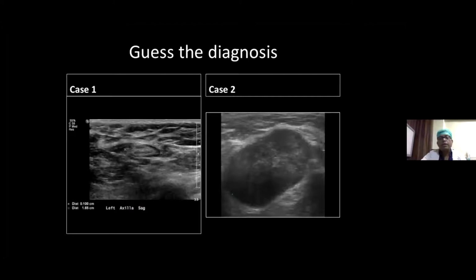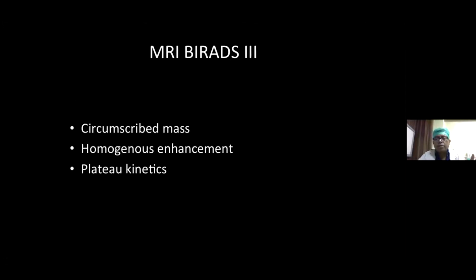But as I said, this is a clear-cut lesion in the axilla, which has got a normal hilar echogenicity maintained. This is an absolutely clear hyperplastic node, and this is a globular one, which is a definite metastatic node. But I was asking you to look at the cortical thickening to understand the significance of an early metastasis.